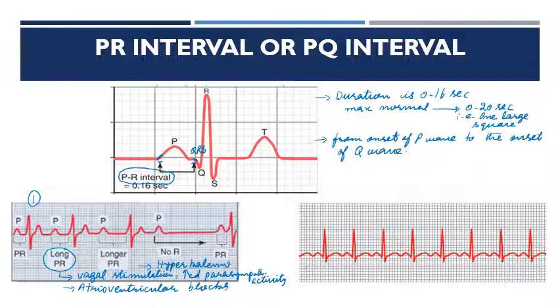And this is a very important sign of hyperkalemia.